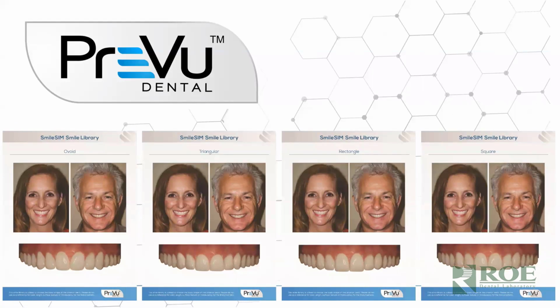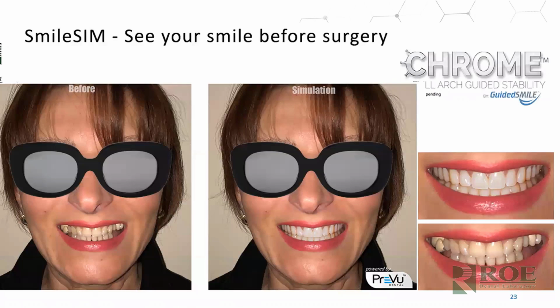So when we set a tooth, for instance, when we set a triangular mold in the software, it's the same as the smile. So is it a one-to-one? No, it's not. But it's pretty close. It's definitely an A, especially in the patient's eyes. It's an A, A to A plus. So we use those smiles.